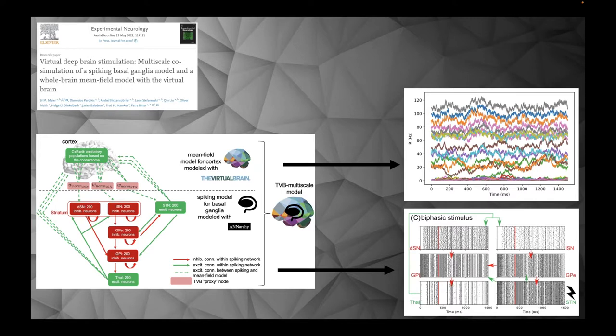So far, it seems all still okay. We were in reasonable ranges, but you can, of course, always do better and you can always be more precise and catch more individual variability by setting your parameters looser. So we tend to stay with one or two parameters with TVB to optimize, but when you have good justification, you can go even further, and when you have good computing power. But you need a good interpretation. You cannot just say, oh, every parameter goes from 0 to 1,000. That's not making sense.